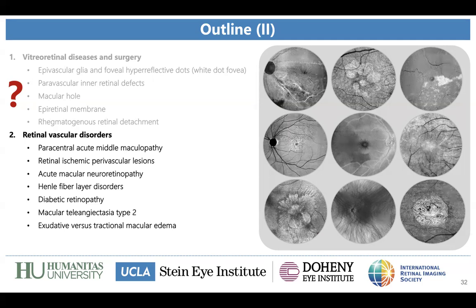Thanks so much, Gabriel. So nice to meet you as well. Unfortunately, this is a limitation of en face OCT, especially where we need very precise and high volume scans, or in certain conditions such as myopia and high myopia, or when there are very high PEDs, for example in polypoidal choroidal vasculopathy. So it's very difficult to segment and have reliable information in these cases.